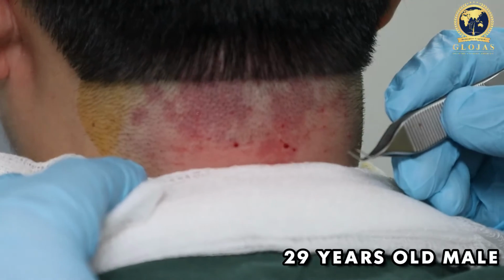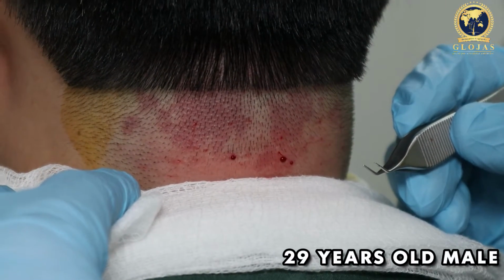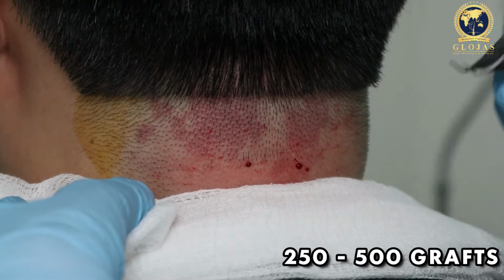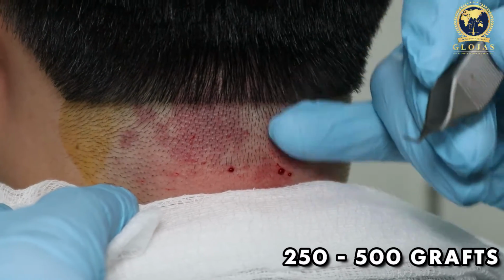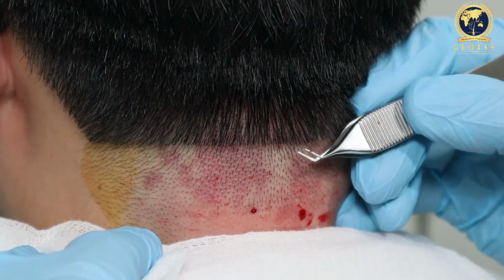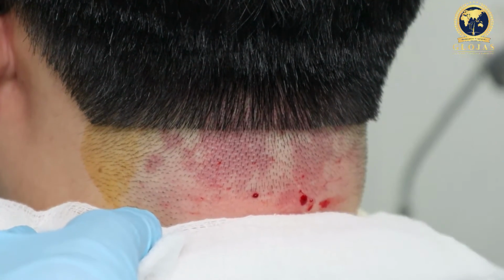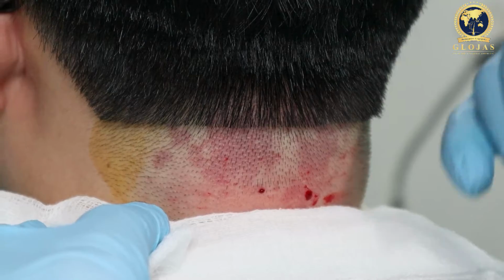So we're just about to start an eyebrow transplant. Now in the eyebrow, the donor area is very important. The best is at the nape of the neck. This hair is very fine, thin, and the caliber of the hair resembles just like the front eyebrow.